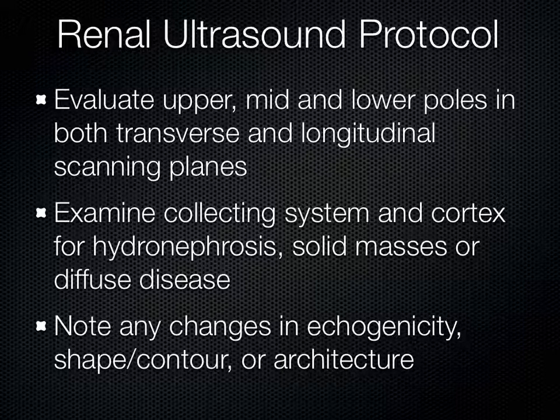When looking at the kidneys, think about the upper pole (towards the head, superior), the lower pole (towards the feet, inferior), and the mid pole in between. You look at them in their long axis, then flip the probe 90 degrees for a short axis. You assess the whole system for its architecture, echogenicity, shape, and contour.